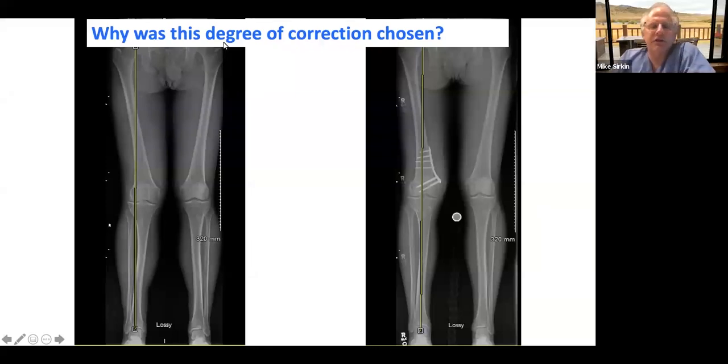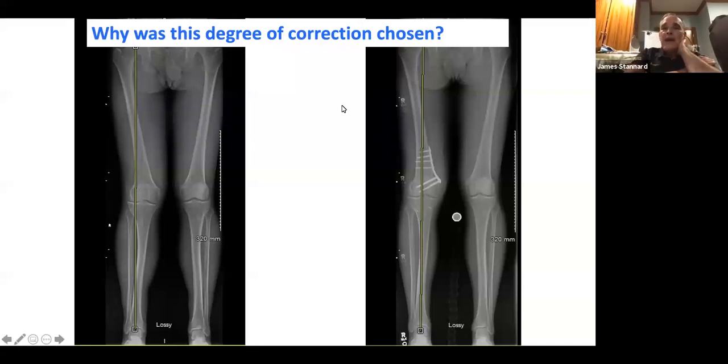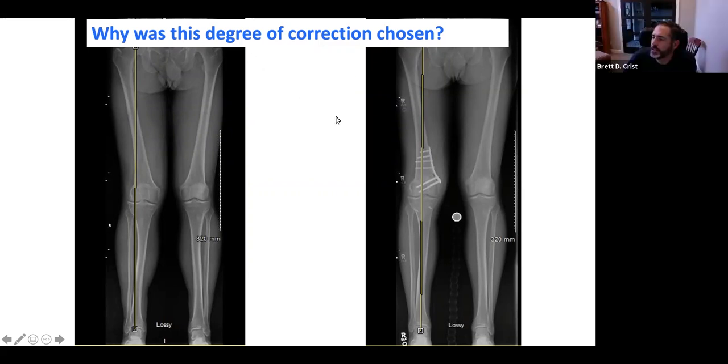So Jim, there's a question here: how do you fix the patella cartilage back into the patella? It's done with bioabsorbable K-wires, a series of 4 of them at least. It seems a little flimsy, but boy, it holds. Again, it's two really rough cancellous surfaces that want to stay together, and so the stability of that has not been an issue. And the ones that are used have the same compression strength as a 2.4 cortical screw.